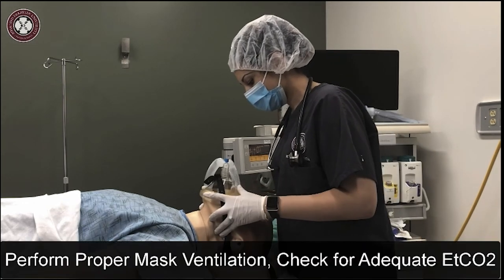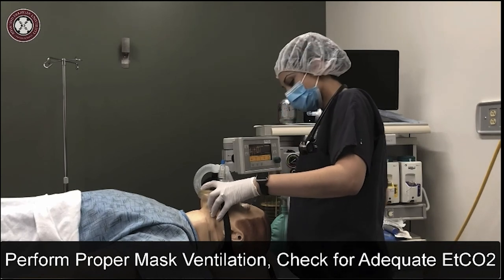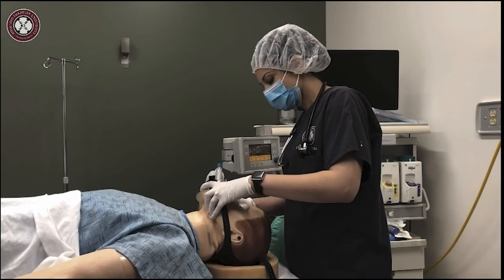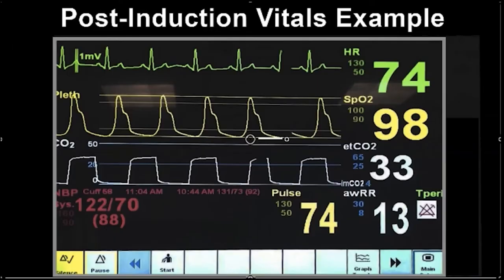Next, ensure the ability to properly mask ventilate. Slightly close the APL, but keep the setting less than 20 to avoid gastric insufflation. Confirm proper mask ventilation by the presence of bilateral chest rise and adequate end-tidal CO2.